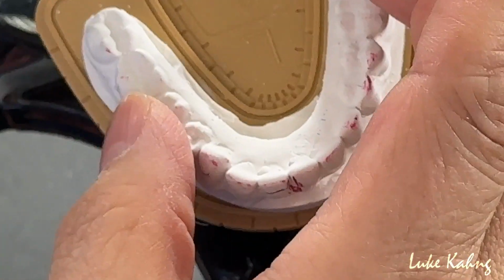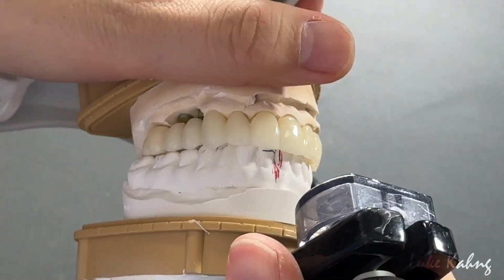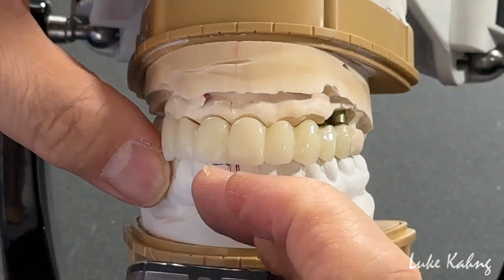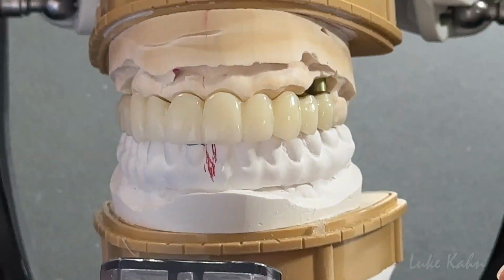This is all the zirconia case too. All right. So I like the buccal contour. I like the symmetry. I like the margin direction.